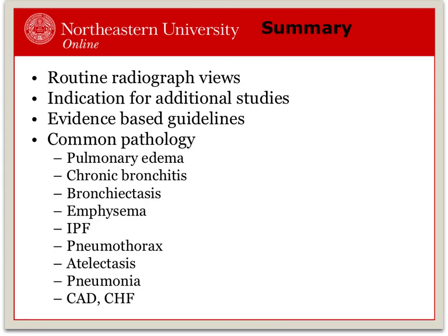In this two-part presentation, we reviewed routine radiographs, indications for additional studies, evidence-based guidelines, and common pathologies. Clinicians should incorporate information from imaging into patient management, but should never rely on imaging diagnosis alone.